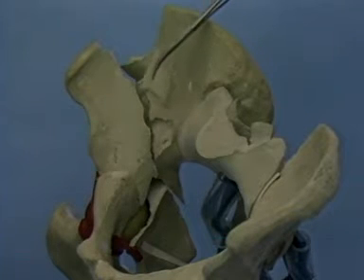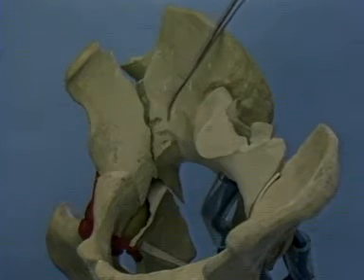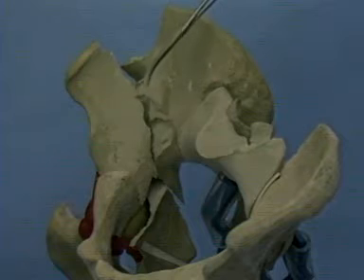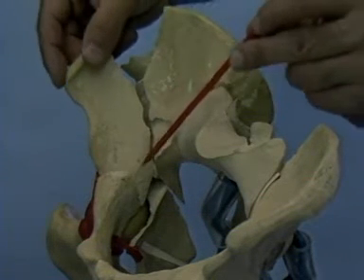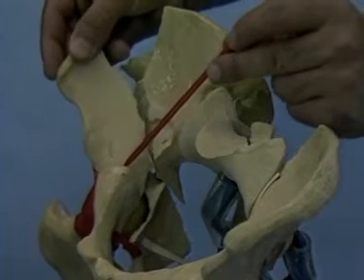A free fragment is detached from the pelvic brim. There is a secondary fracture of the anterior column at the level of the pectineal eminence.